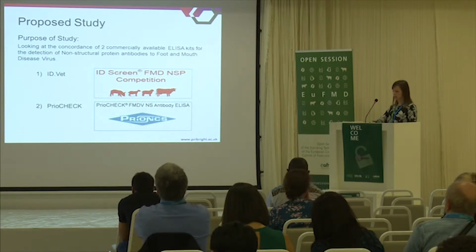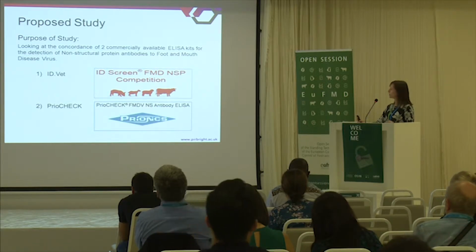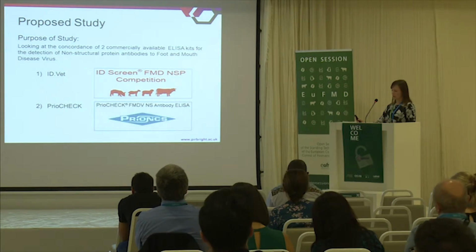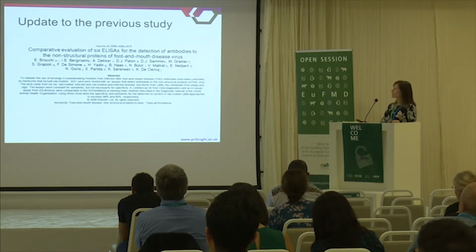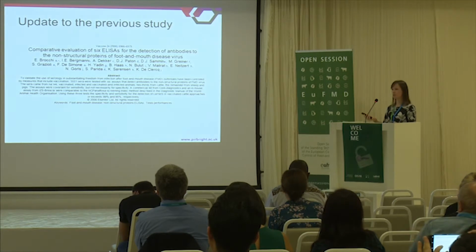Okay, so the study plan was to look at the 2 commercially available kits. We chose the ID.Vet ELISA, which you've just heard from Loic, and the PrioCHECK NSP ELISA. ID.Vet offer the single and overnight protocol. So with that in mind, we looked at Emmy's previous study, which obviously looked at 6 ELISAs. This is only looking at 2 NSPs. Hers had a lot more samples, but we have covered the same species, so cattle, pigs, and sheep.